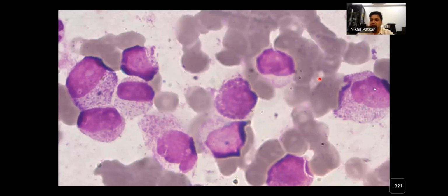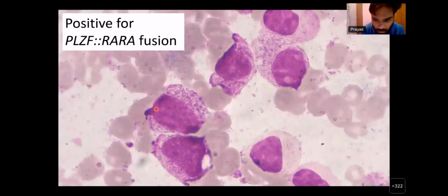Who saw this patient case? Can you go on describing 2A as well? Sir, in this smear, we can see cells whose N:C ratio is high, and nuclear contour is smooth. In the cytoplasm, we see multiple azurophilic granules, and in the nucleus, we see 2 to 3 nucleoli. Similar to that case, this case too has a similar structure. The nucleus is round, it is not cleaved or indented, but on the other hand, as compared to that case, it has coarse granules.